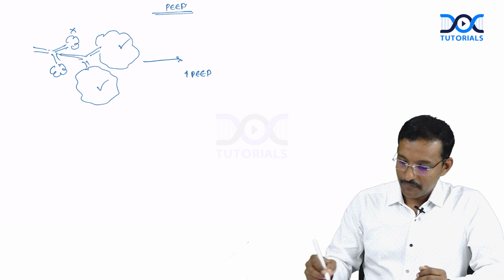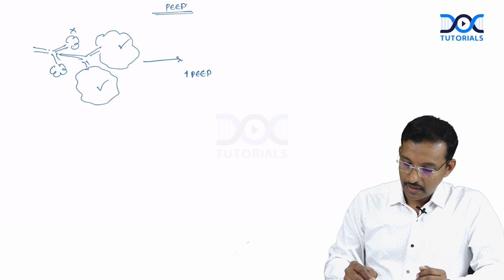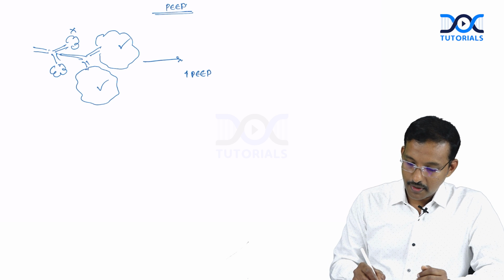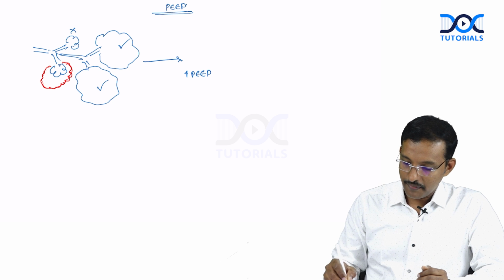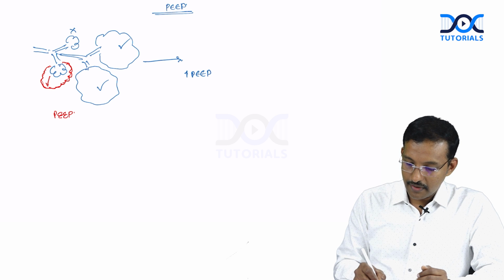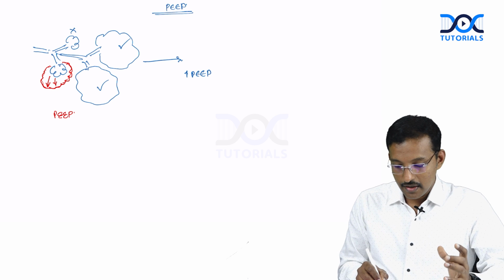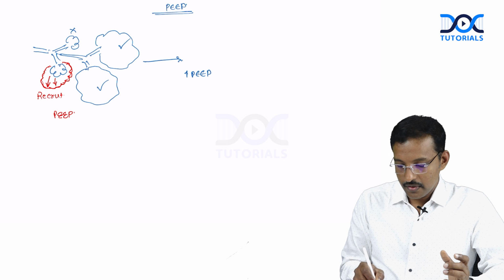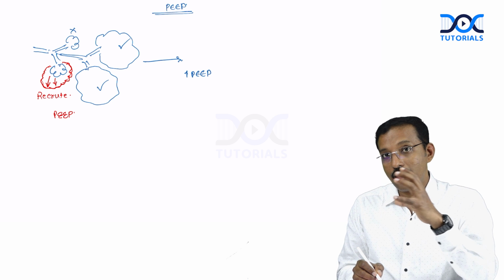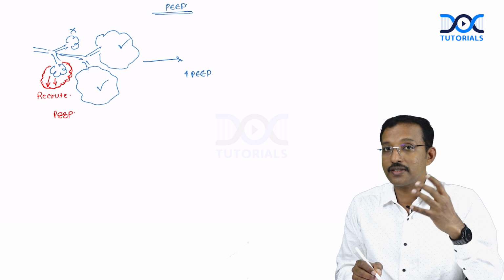Now see this, when you increase the PEEP, the alveoli which were not taking part in ventilation open up. They start taking part in ventilation when the PEEP is applied. So PEEP applied, there is an increase in ventilation. Another alveolus has started. This is called recruitment. So I have recruited one more alveolus to take part in ventilation. So more surface is there for exchange, oxygenation improved.